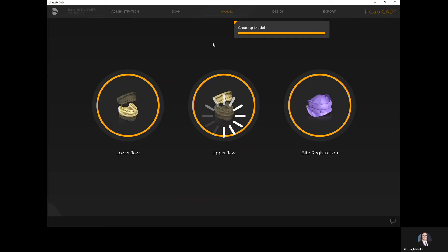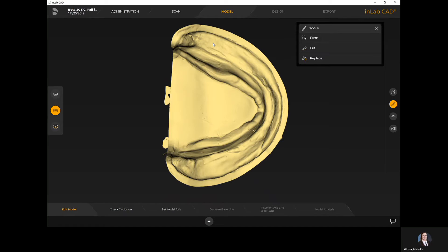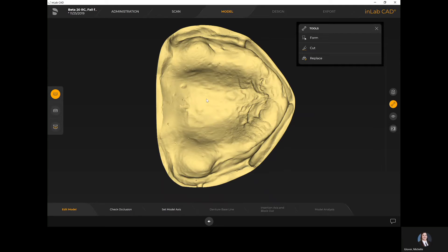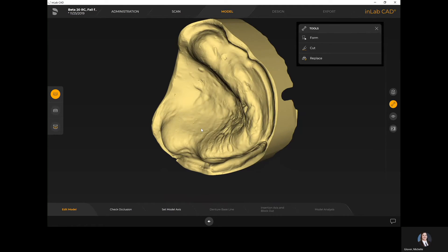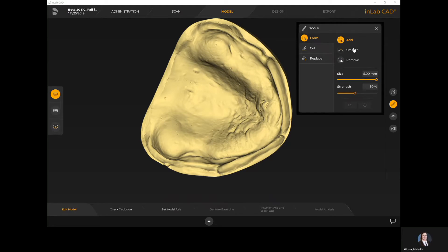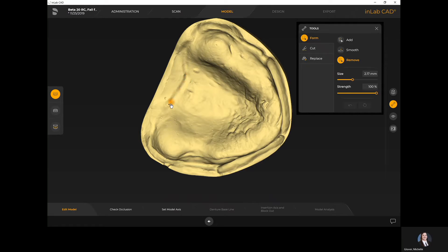The system is just loading my STL files — I am working off a laptop so it does slow down a tad. Once in the edit model step, under the tools I have the form tool where I can add, smooth, or remove material from the model. I have the cut tool to physically trim something away, and the replace tool which is handy to fill in small holes. On the far left-hand side I can go between my upper jaw, lower jaw, or bite rim. Here I can actually see I'm placing a post-dam into the model itself using the remove option — so if you took an intraoral scan, you can still add a post-dam using the remove tool in the edit model step.